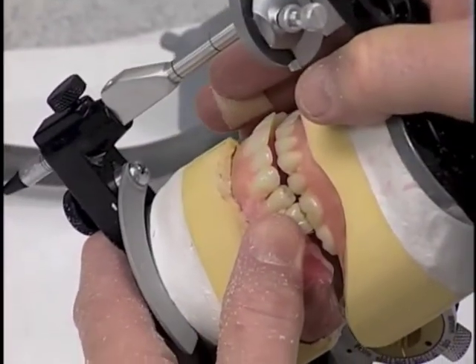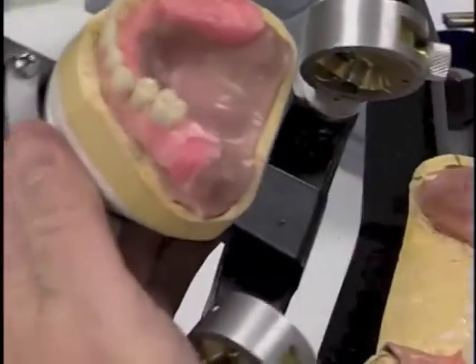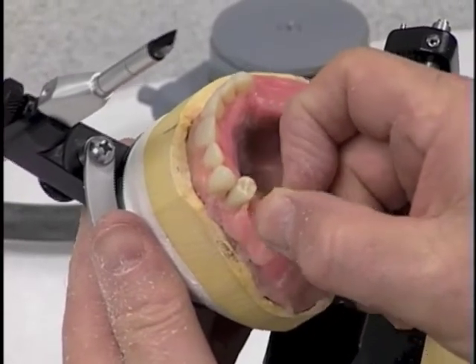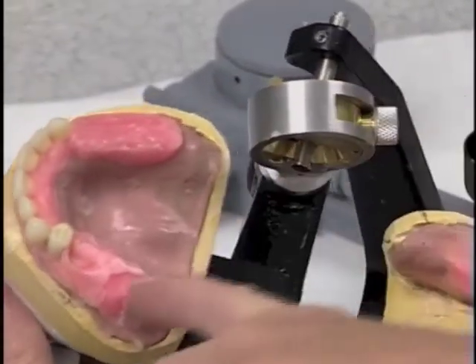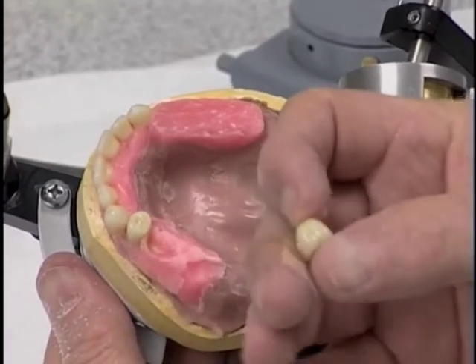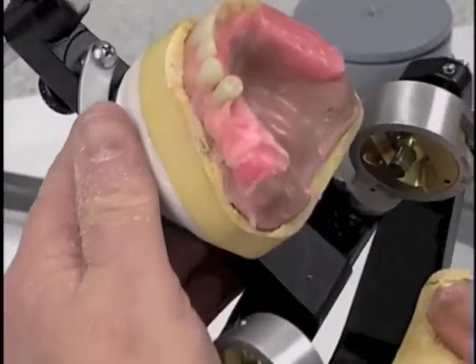Close the articulator. The lingual of that is not in quite far enough because that buccal cusp is hanging down a little too much. And we can see we have an interference right there, which means that we're going to have to trim a little of the collar of that tooth off, just a little bit on the first molar.